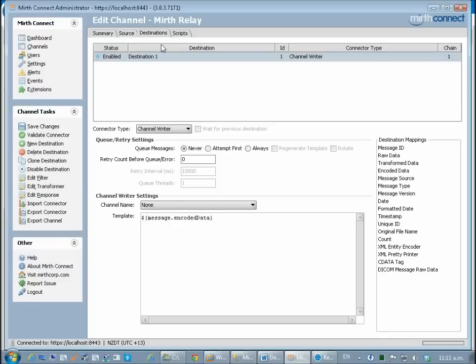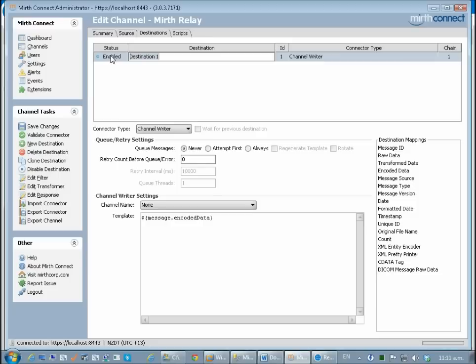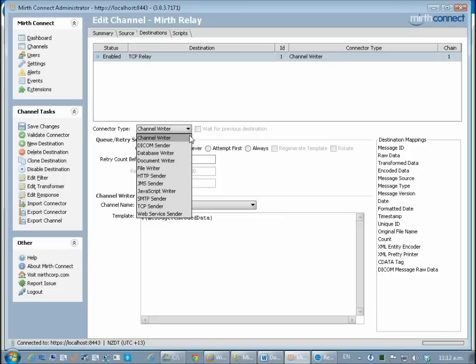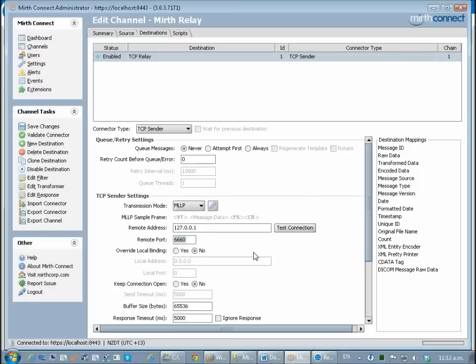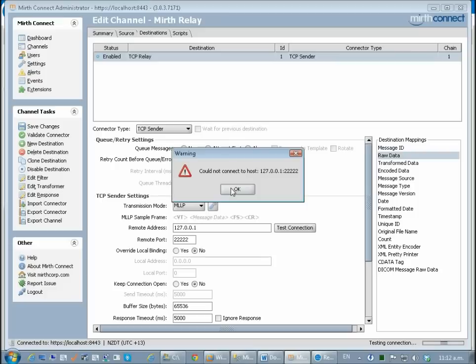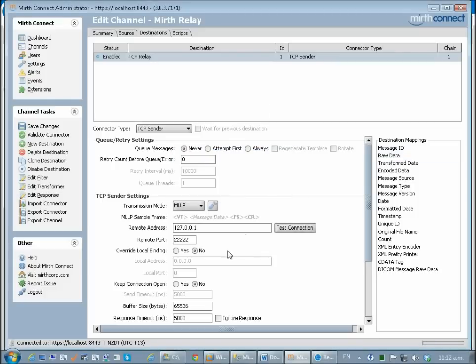Now I'm going to create the destination. My first destination is going to be my TCP listener. I'm going to call this TCP relay and it is going to be changed across to a TCP sender. We're going to forward that on to another system that's going to be listening for it. I'm going to configure that to port 22222. Now if I test this connection there's nothing running at the moment so I get an error response.